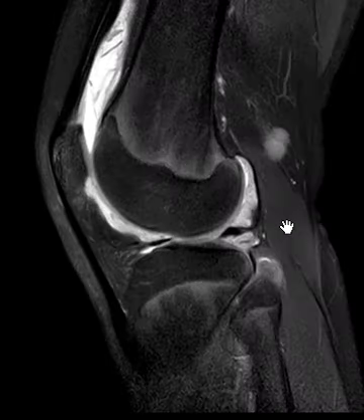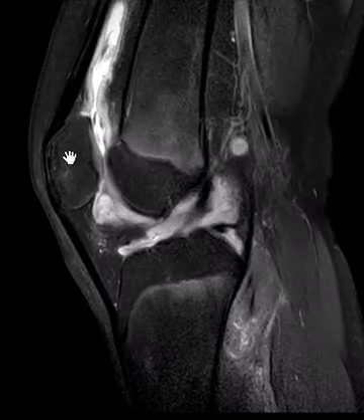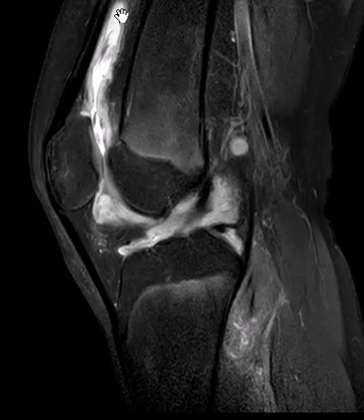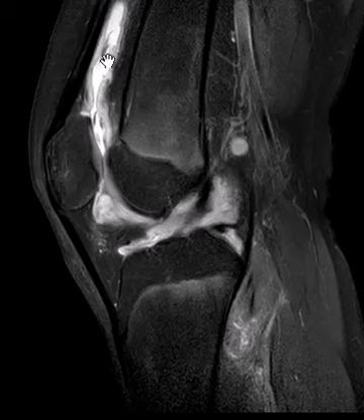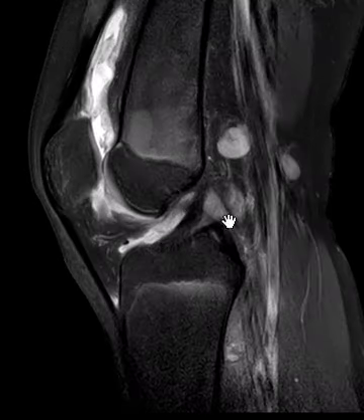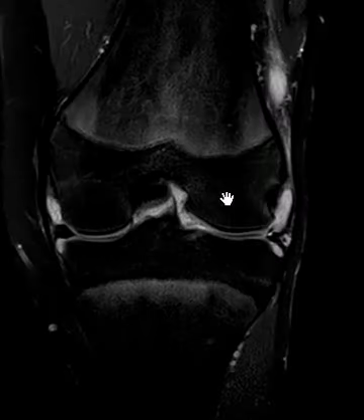Back over here we see an enlarged lymph node, and here's another enlarged lymph node that goes along with infection or any inflammatory process. Over here we have that lymph node. Looking from the side — here's the kneecap — you get a sense of how extensive this is. This is the front of the knee joint; the knee joint goes way up here and it's diffusely inflamed with complex fluid.